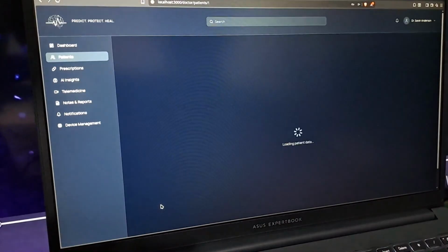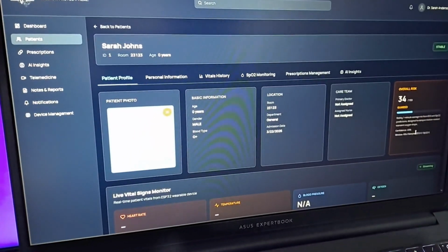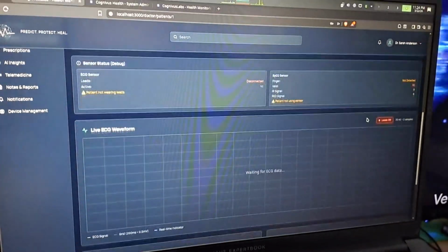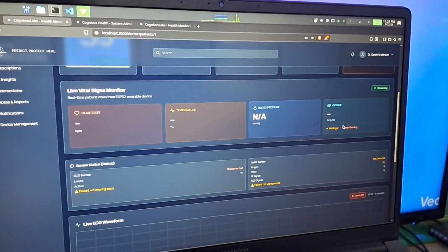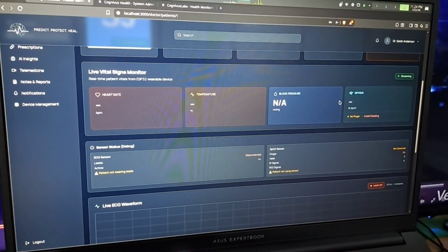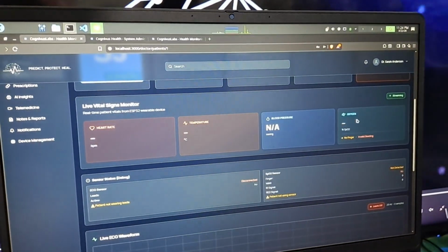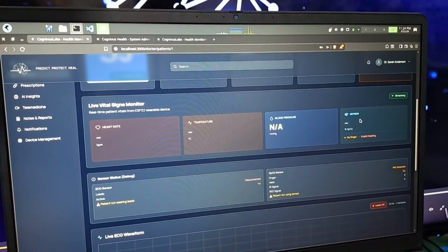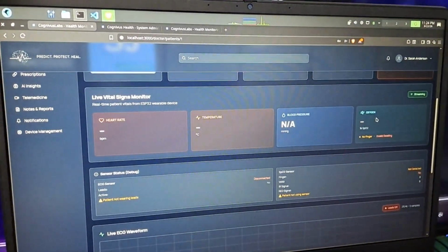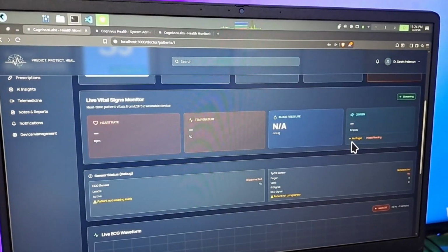So if we go to the profile section, it will load. As you can see, we can see the overall risk. It's better if you have a lower risk. If we scroll a bit to the bottom, as you can see, all the sensors are not active right now because we didn't connect the ECG sensor yet. And for example, we will show the SpO₂ sensor. So I'm going to put my finger on the oxygen SpO₂ sensor, and we can see how these oxygen levels are moving.